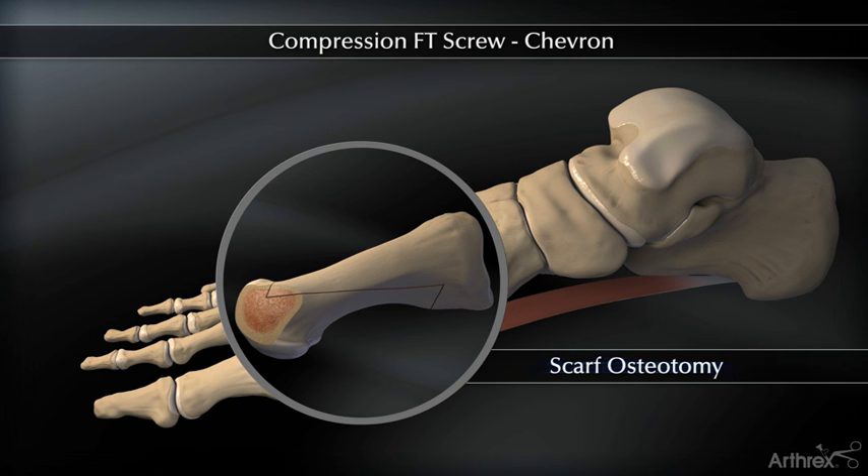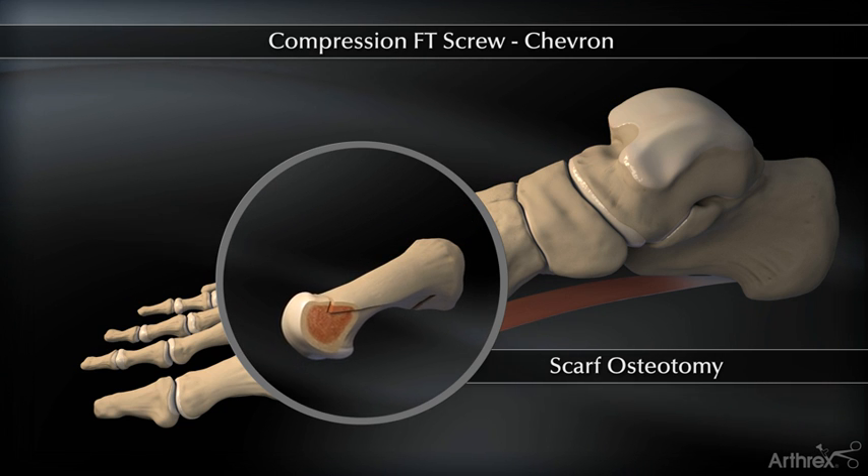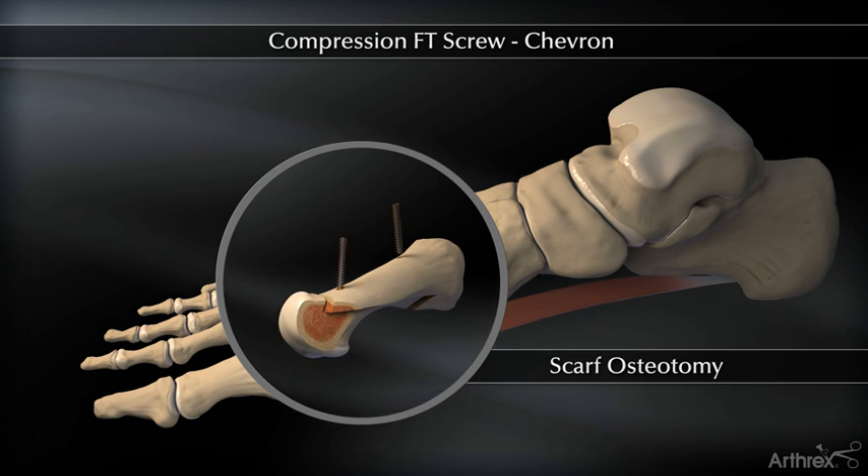For scarf osteotomy, follow the same steps as described above. Use of a bone clamp can be helpful to hold alignment prior to fixation being achieved.